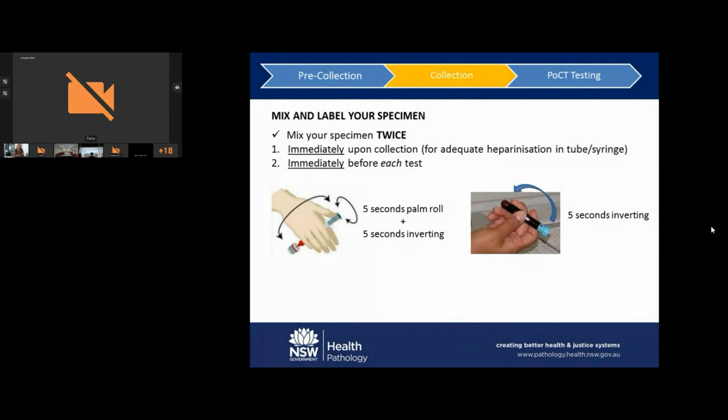And here's what 10 seconds of silence sounds like. So is that how long you mix yours for? And if not, you are not mixing enough.